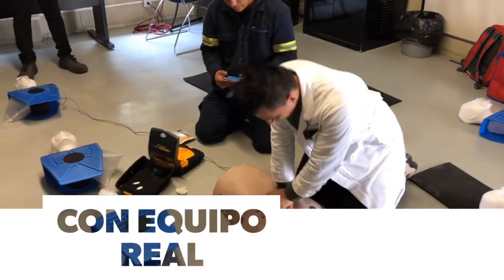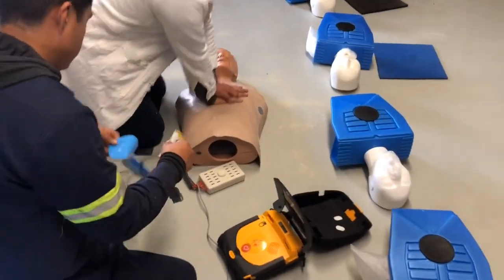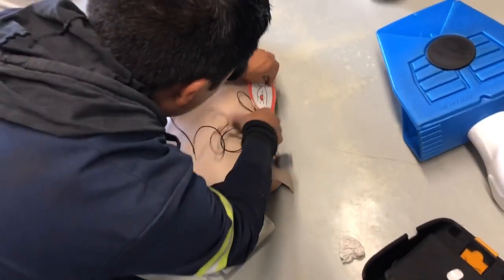Coloca los parches — te sugiero que los desprendas del extremo. Bien, entonces, colocamos arriba, donde está el metal. Ahí.